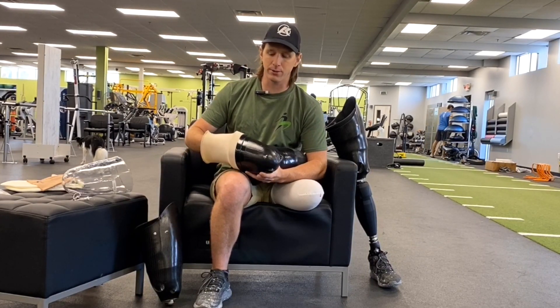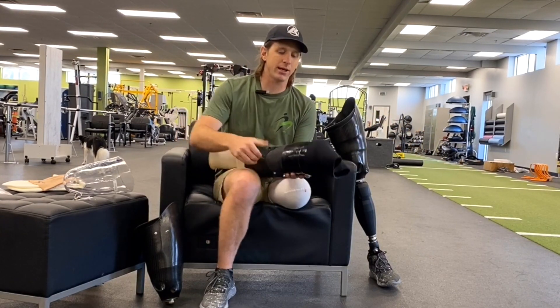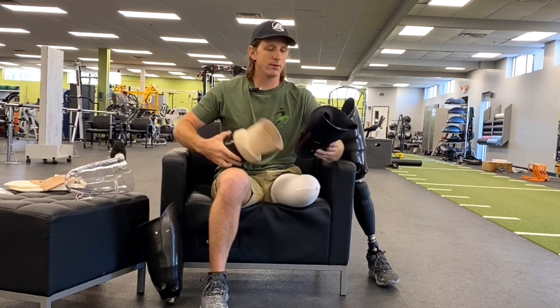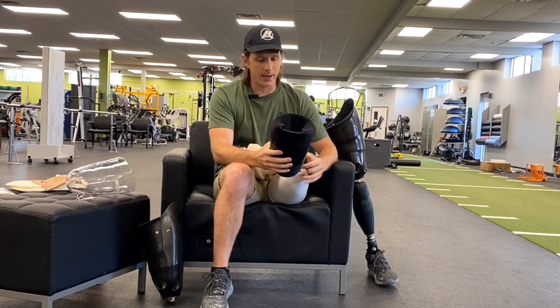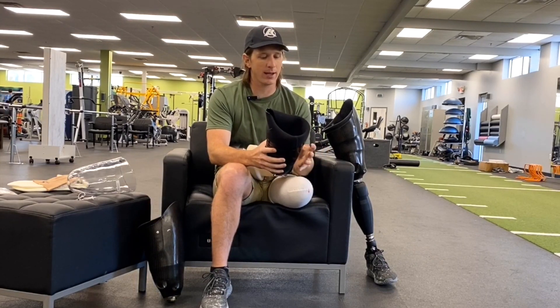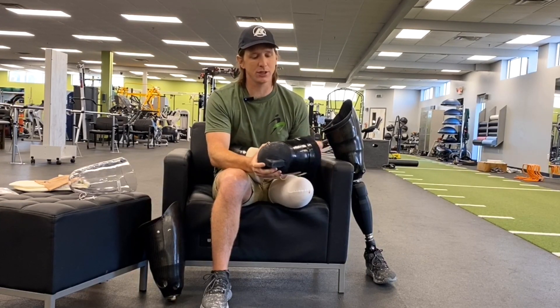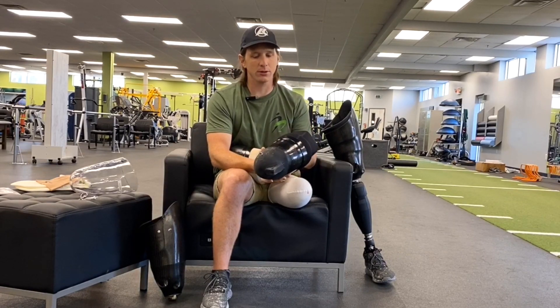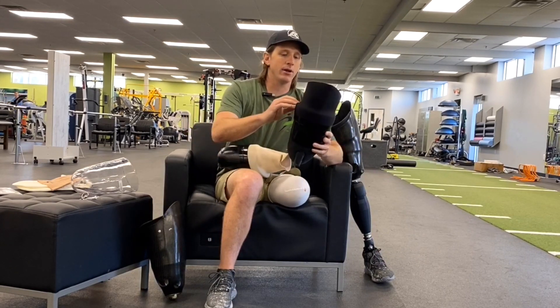Here we have the hard inner and the flexible inner. The main difference is with the flexible, it kind of contorts to my limb as the day goes on — so if I lose or gain volume, it shrinks or expands a little bit. It also has a really smooth walk, almost like a built-in shock absorber as I take each step.